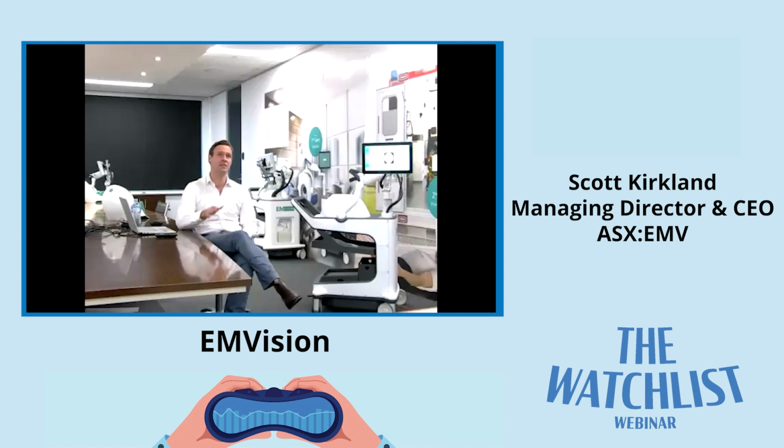And it's very hard to move them down to radiology; it can take a few hours. Quite a few team members are involved in that transport process. And so if you can routinely monitor these patients, particularly high-risk patients, there's a good chance we can pick up complications much earlier and intervene earlier to reduce their length of stay in ICU. So that's all critical information.